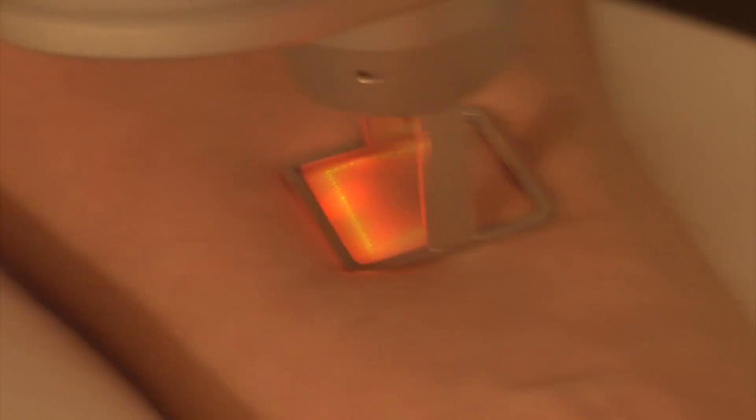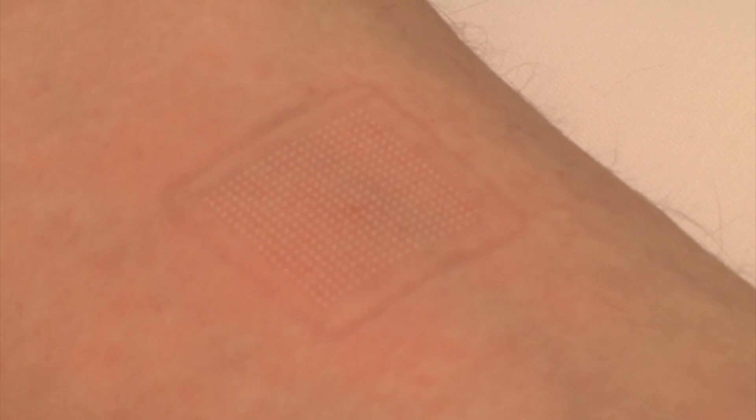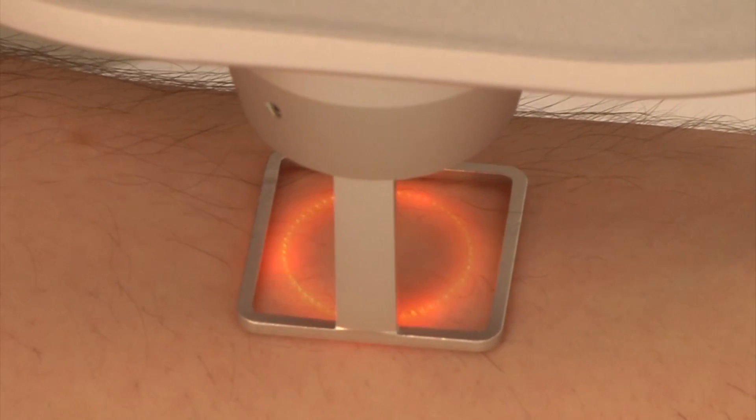I'd like to just provide a brief demonstration of how the scanner works. As you can see, the red lights that are flashing will illuminate the scan area. By depressing the foot pedal, we activate the scanner, and it will paint the microthermal zones sequentially until it completes the scan field. As you can see, each microthermal zone is very tiny, and the skin in between the microthermal zones is completely spared and untreated. I can also demonstrate to you the geometry of a circle.